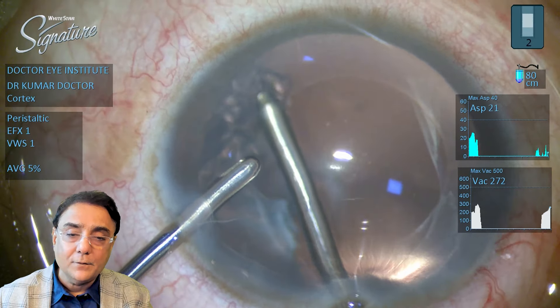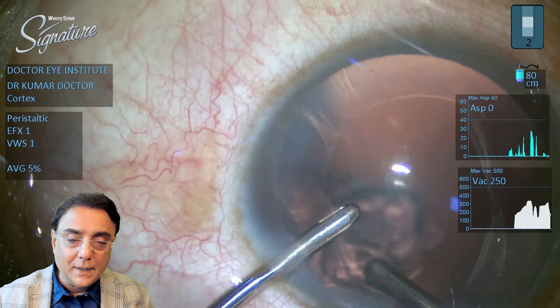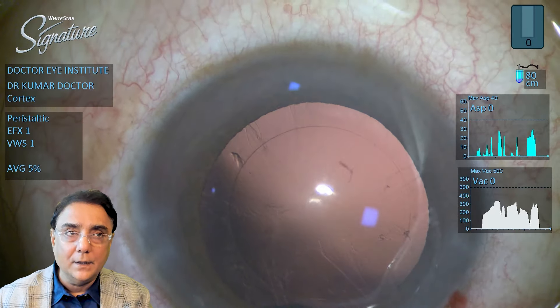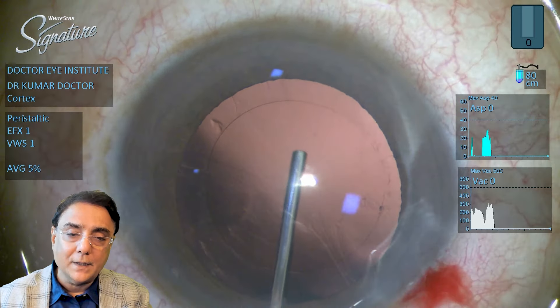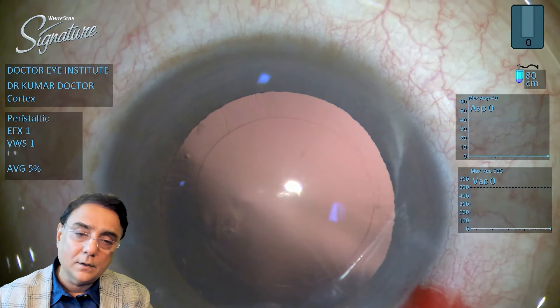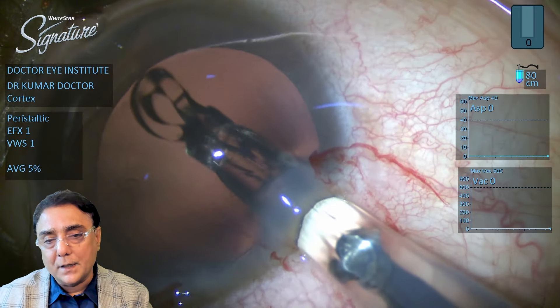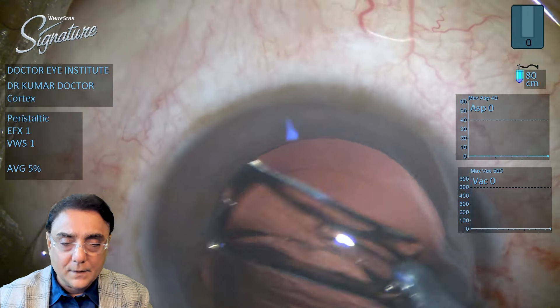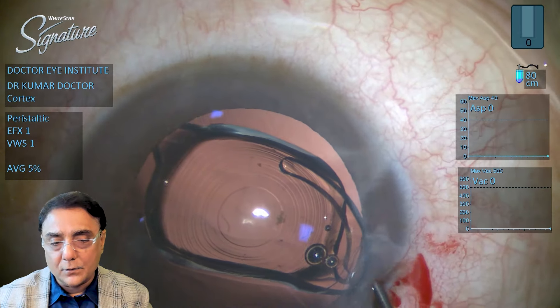This patient wanted a trifocal IOL, so we have to implant the lens into the bag. I like to implant all IOLs horizontally, which is known to prevent negative dysphotopsia, or at least help the patient prevent it. Fill up the bag — I always use a viscoelastic inside the bag rather than hydro implantation. You can see the leading haptic gently opening into the bag, and then the trailing haptic is nudged or dialed and rotated into the bag.